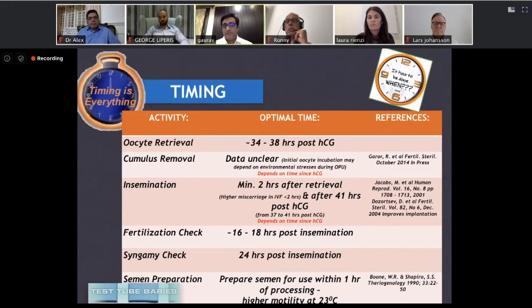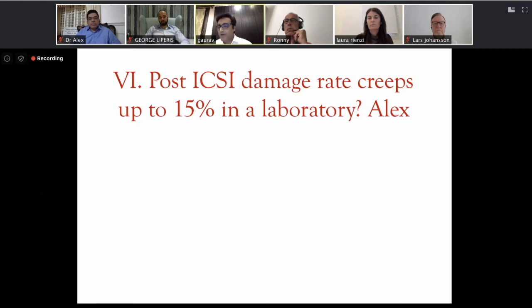All right. So this is just a slide telling us how important timing also is, which Laura just talked about. Whether it is about cumulus removal or denudation, insemination or injection or sperm preparation, everywhere timing has now been re-emphasized as one of the most important parameters. So now, Alex, this is a question for you. Like Laura just mentioned, in a particular laboratory they somehow managed to increase the damage rate post-ICSI to about 15%. So how do we curb the situation? How do we fix it?